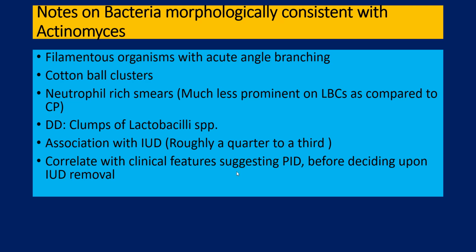So if one finds the presence of Actinomyces in cervical smears, it doesn't necessarily mean that the IUD has to be removed immediately. Only when there are other associated features of PID, the gynecologist will consider doing so.